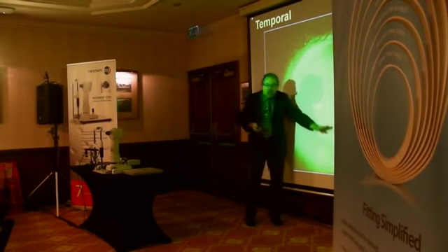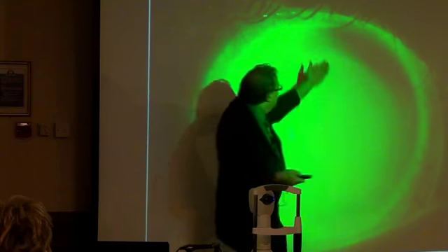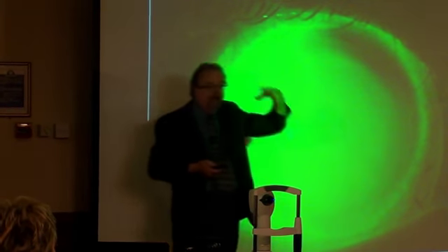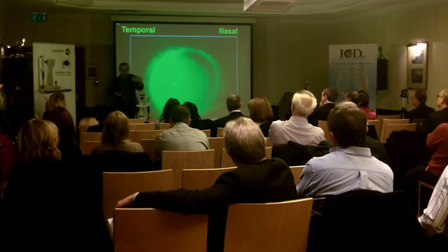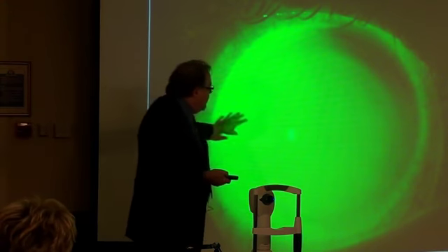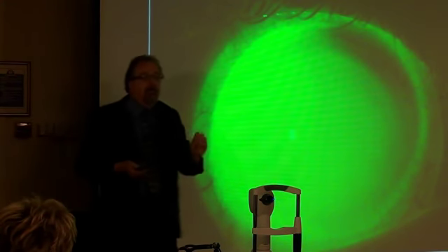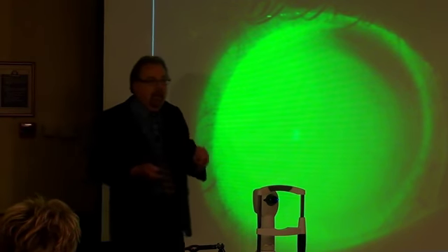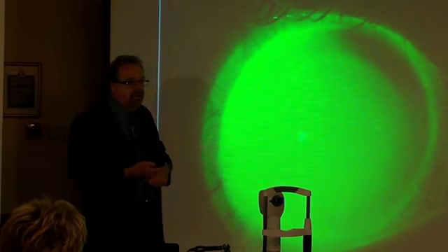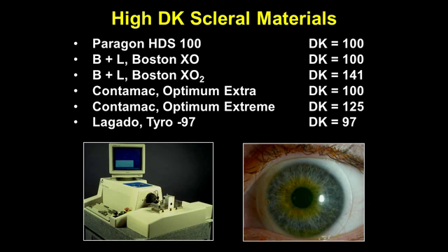So with that 1/4 millimeter of dropping, we do get a tiny area of thinning up here. That goes away when the patient moves their eye with excursion, so it is not a major issue. But you'll always be able to tell the nasal side based on that thinning of fluorescein.